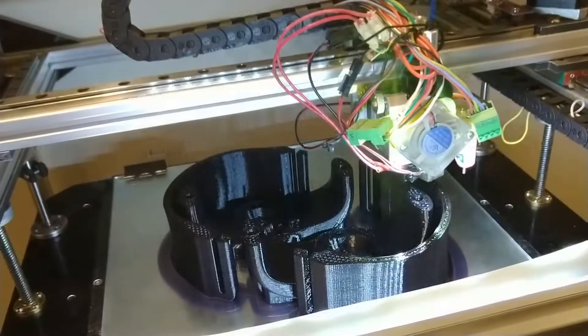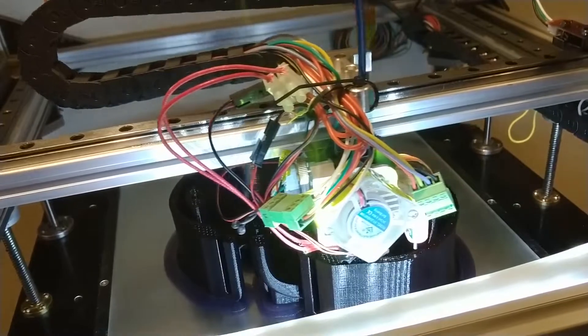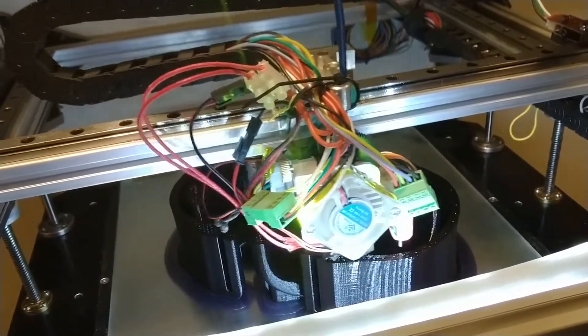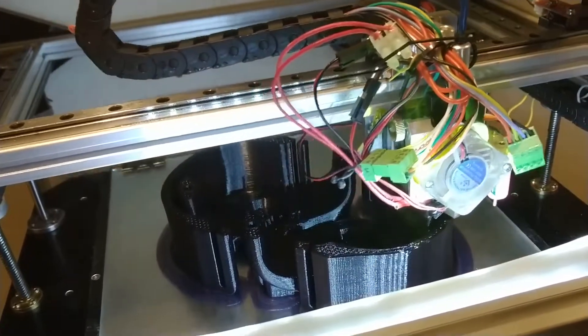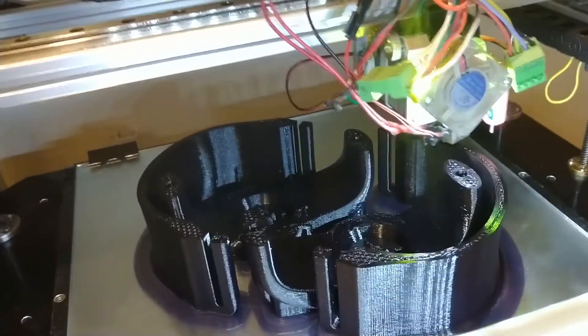In this particular case, this was maybe the fifth or sixth iteration that we actually built on the 3D printer. And all told, we maybe went through 20 different iterations in the modeling software before even building our first prototypes.